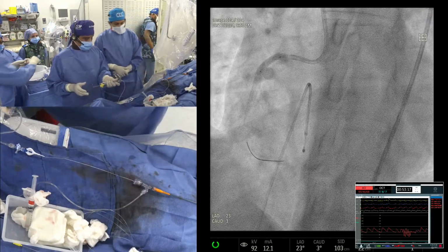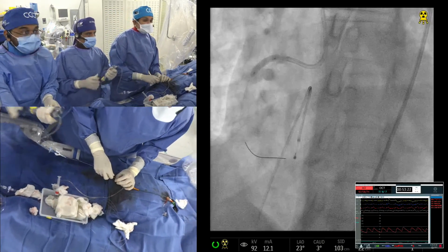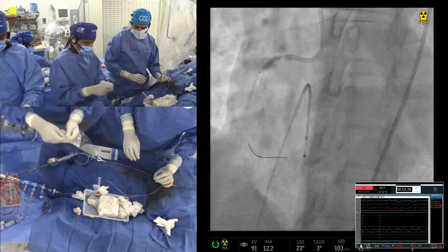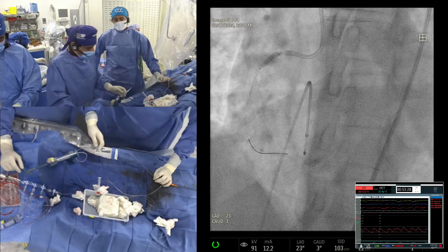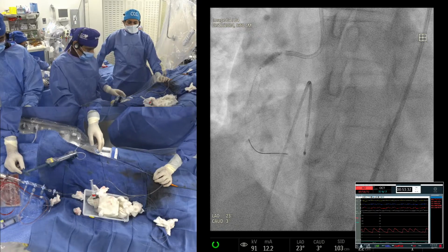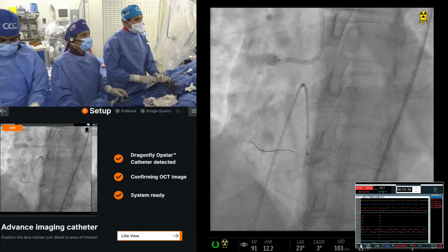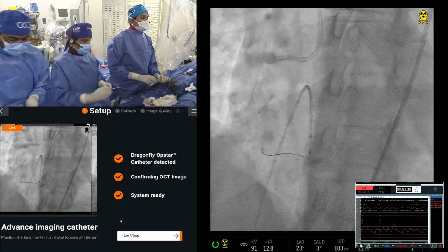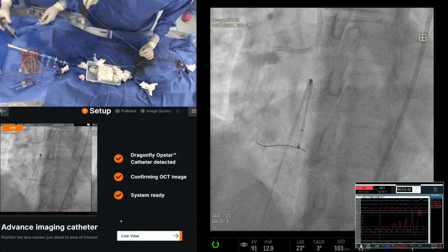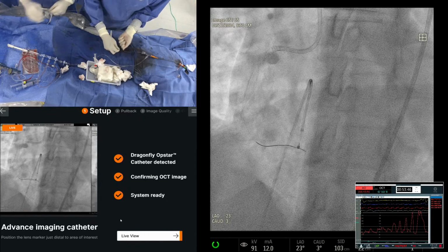Should we do it with STs? No, the STs are good now. So, Samin, the question is for delayed flow, do you prefer nitroprusside or adenosine? All three. No, we don't have adenosine. We are not that big a fan of adenosine. Nitroprusside, verapamil, and nitroglycerin. Not so much nitroglycerin, but I think nitroprusside is probably better. But some people feel adenosine, because I know some attendings even here in our lab like adenosine. But I think between adenosine and nitroprusside, one of the two.